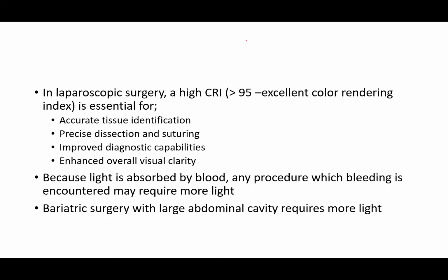Now, because light is absorbed by blood, any procedure in which bleeding is encountered requires more light. And you should know, bariatric surgery with a large abdominal cavity will require more light.